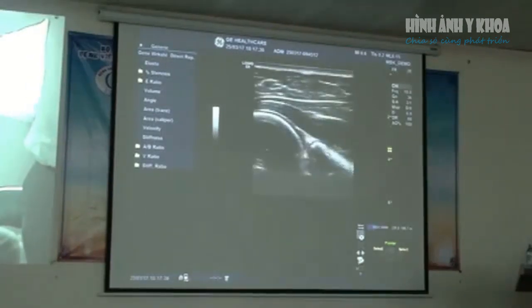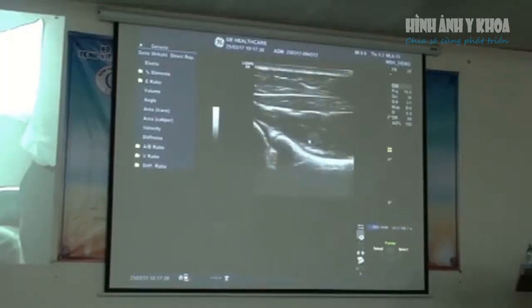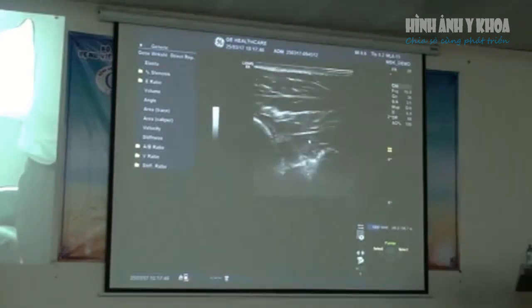So to get to that plane, from the posterior joint, we just slide a little bit more posteriorly and angle up towards the patient's head. Nhắc lại là chúng ta sẽ di chuyển về phía sau một chút, hạ xuống và vẽ góc đầu giò lên trên.